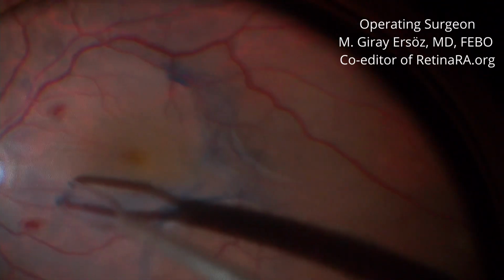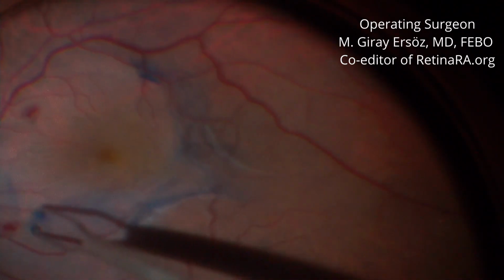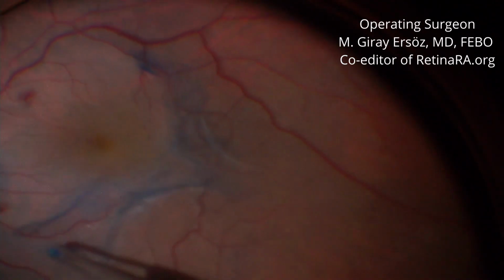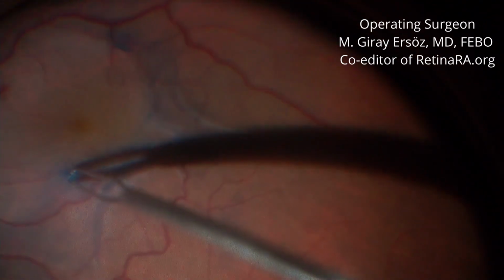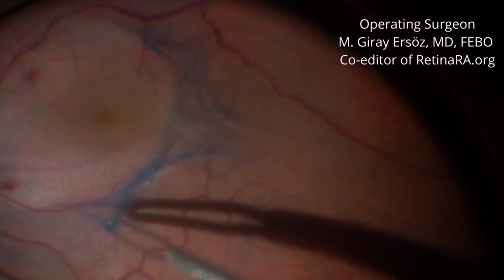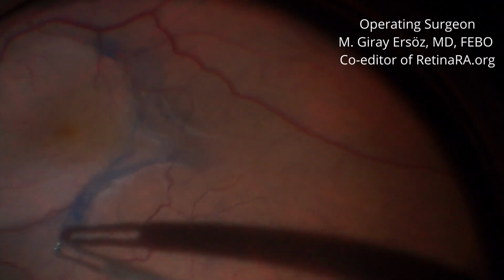Because I use the pinch and peel method in ERM cases, both ERM and ILM are usually peeled together. However, even if I suspect the ILM hasn't peeled, I don't attempt a second staining or peeling. I believe a second peeling procedure can damage the retina if the ILM and ERM aren't peeling together.